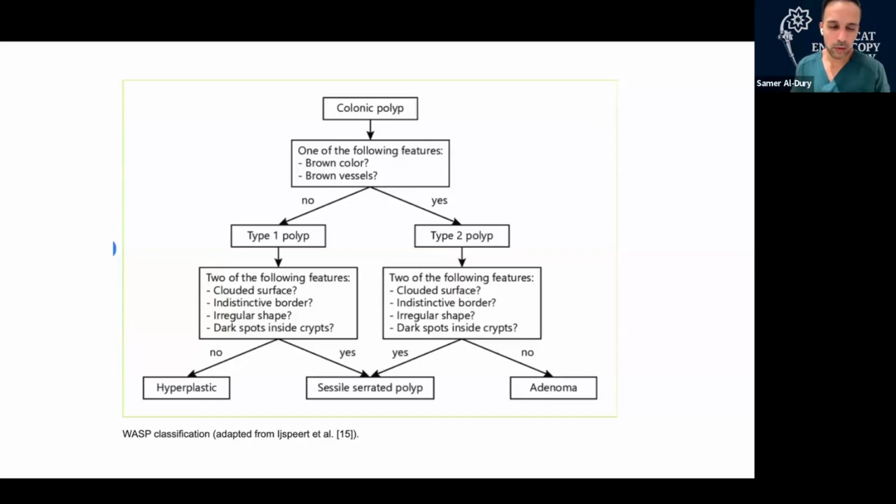Whatever was left in the small intestine, that fluid mixed with bile, finds its way into the right colon, and that becomes a nightmare, because cleaning up this sticky bile-mixed fluid takes a lot of time and makes it difficult to find sessile serrated lesions.